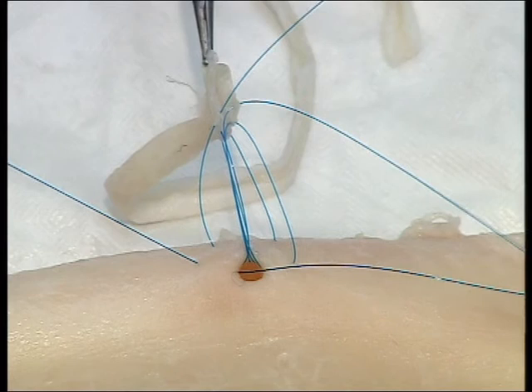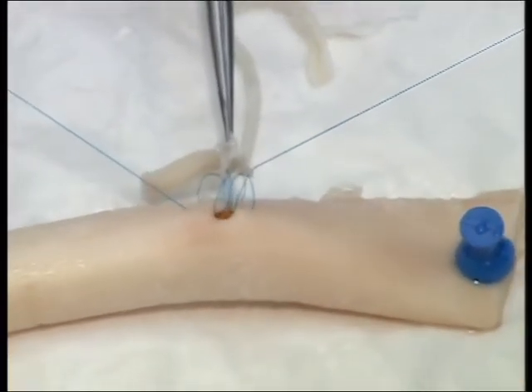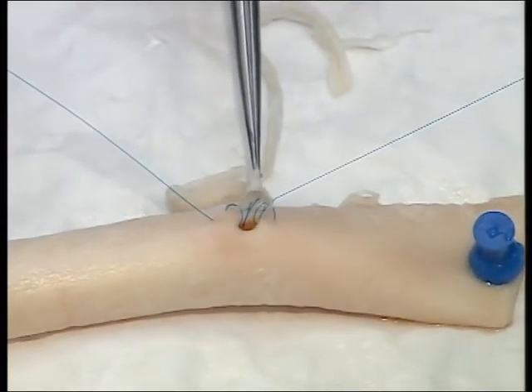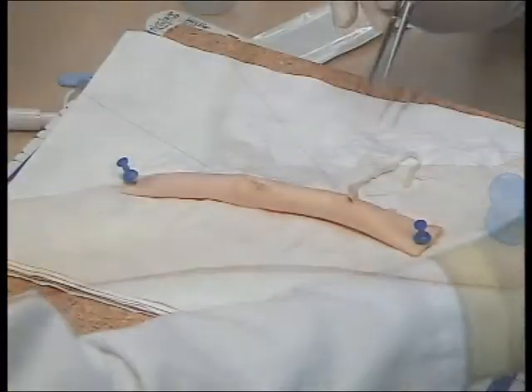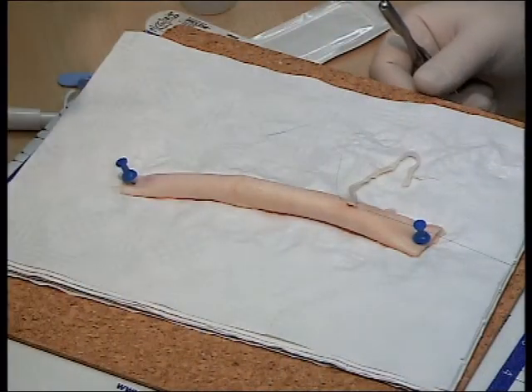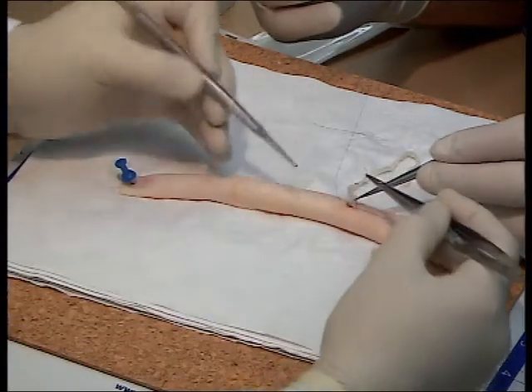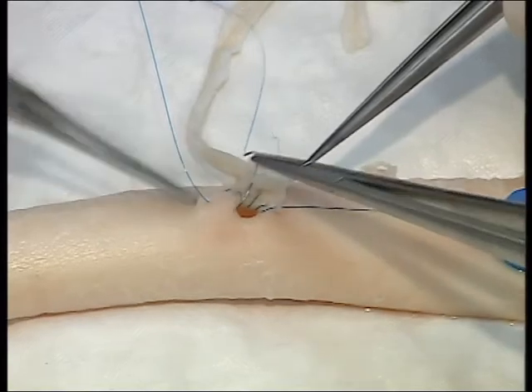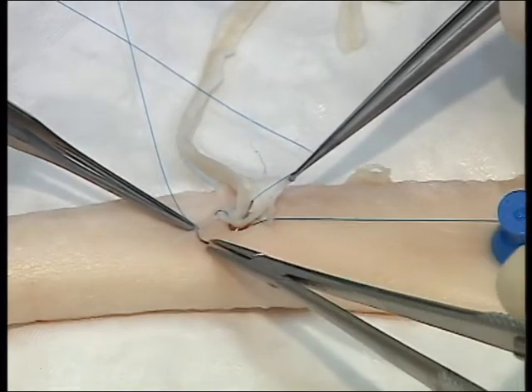you are now in a position to lower the conduit onto the aorta. Lower the conduit gently, without tension. Your assistant plays an important part in this. Now, using the same suture, continue the anastomosis passing from inside the aorta to outside.